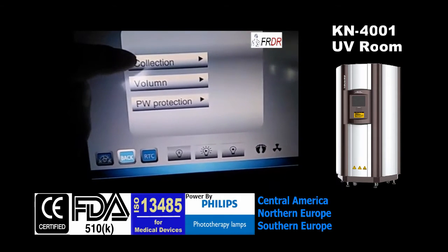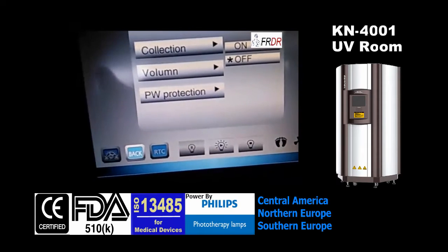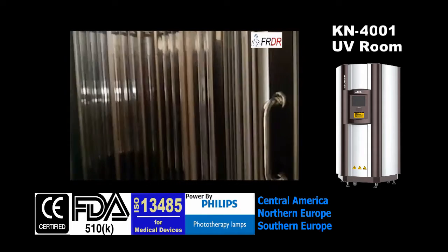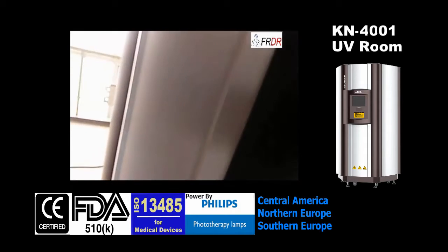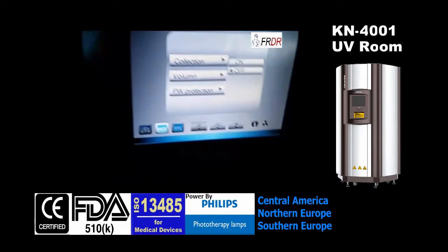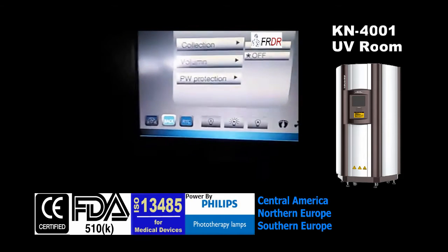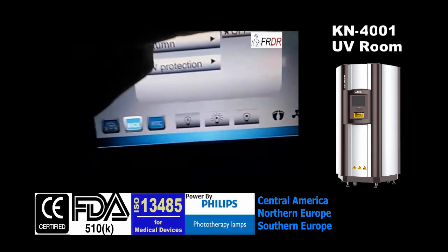For system setup, we can set the intensity calibration. There might be an intensity tester — the intensity tester is optional. When we equip this intensity tester, the machine can automatically perform intensity calibration every time we choose to turn it on.